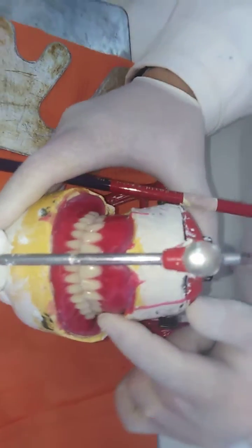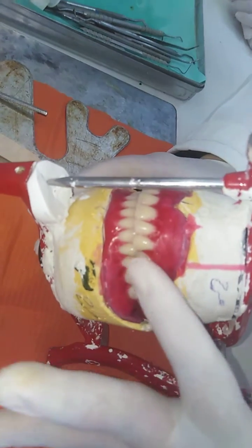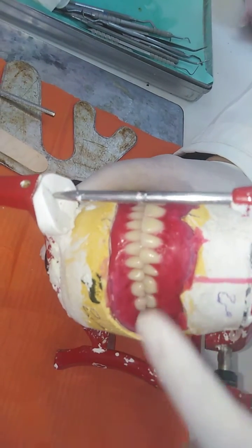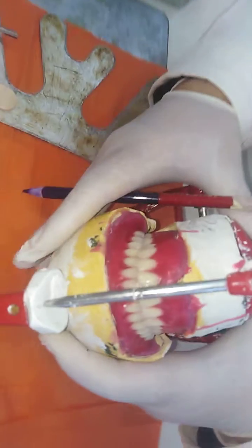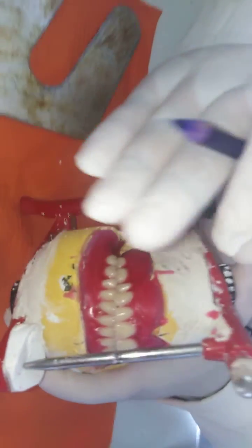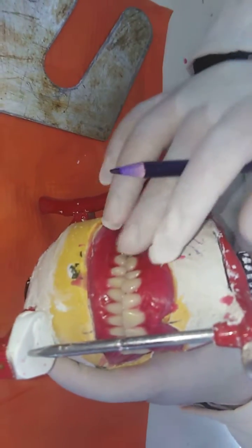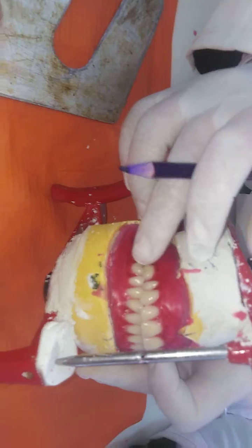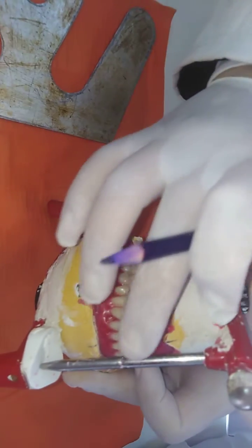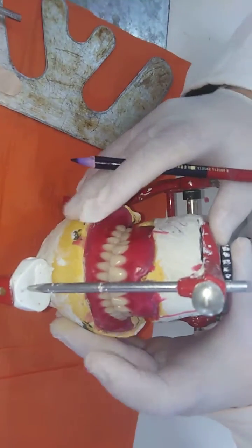But look posteriorly, they had to produce a crossbite. So they set the lower teeth more buccal than the upper teeth to solve the problem of the wide mandible. In some cases that are moderate, only unilateral crossbites are sufficient. In other cases that are mild class 3, we only satisfy ourselves with the anterior setting, the camouflage anteriorly.